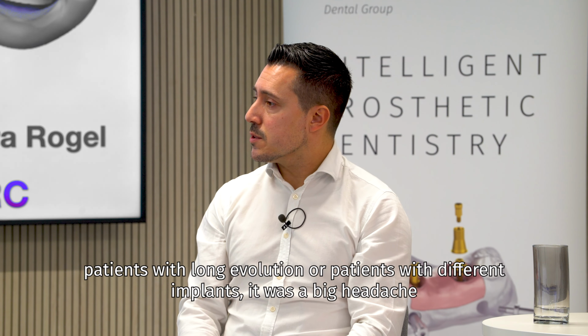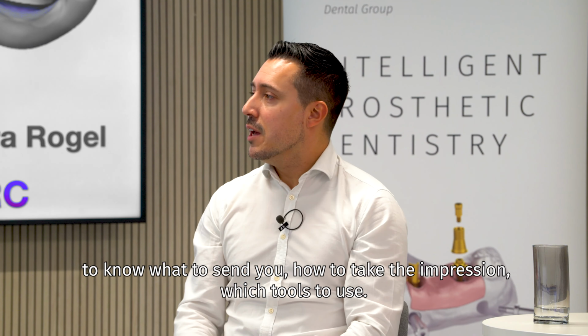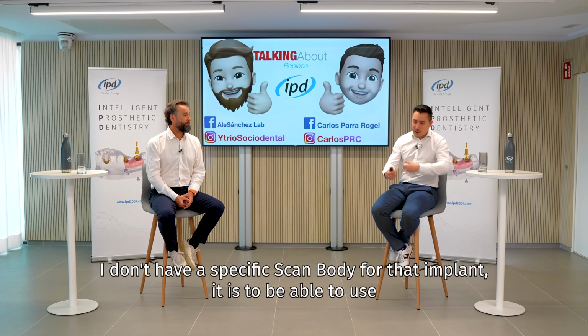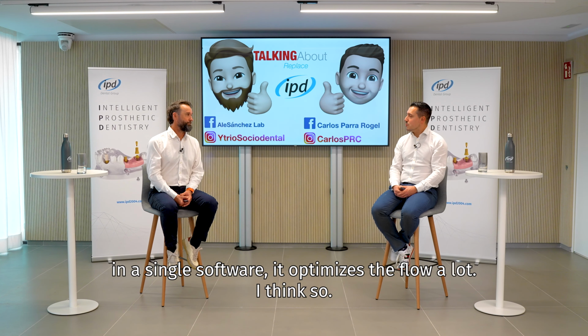with different implants. It was a big headache to know what to send you, how to take the impression, which tools to use. I don't have a specific scan body for that implant. It is to be able to use different tools to give a solution to that treatment so that you can put it all together in a single software, which optimizes the flow a lot.